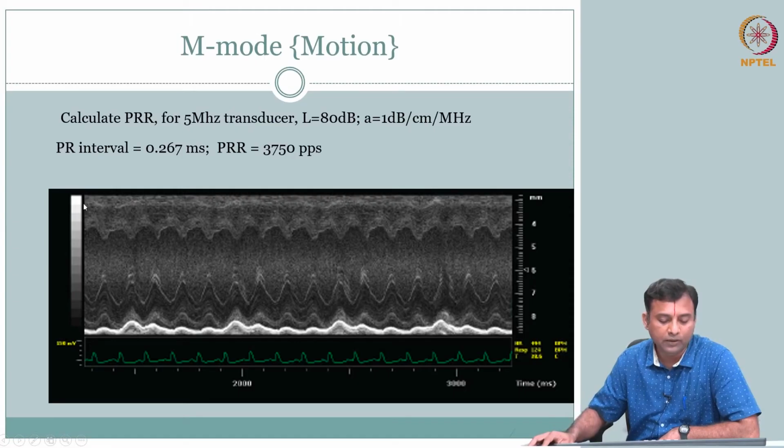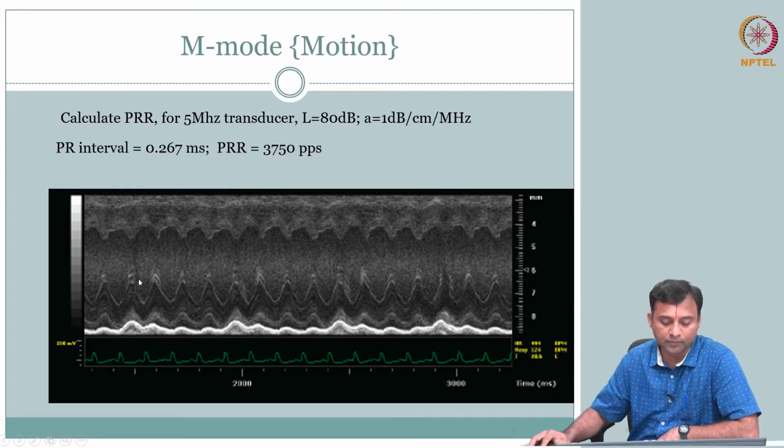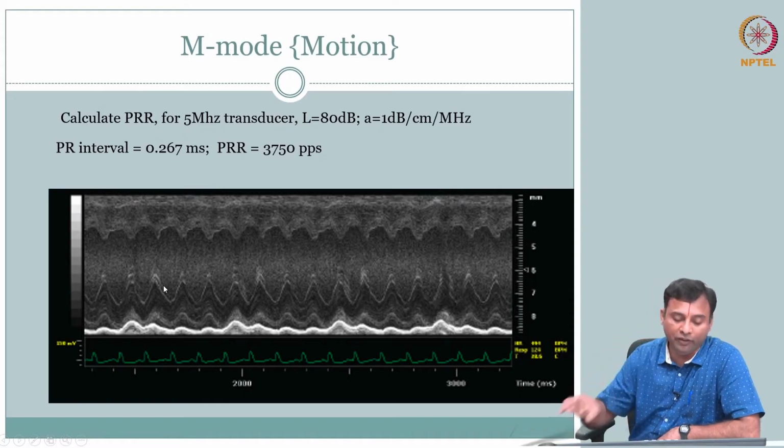So, therefore, it is not oscillating, whereas along its path there are several interfaces, very weak, very weak scattering, right, whereas this prominent interface that is moving within that path, you can notice. So, you see how powerful this is. This can visualize if the flap is opening, moving, right, the frequency with which this.